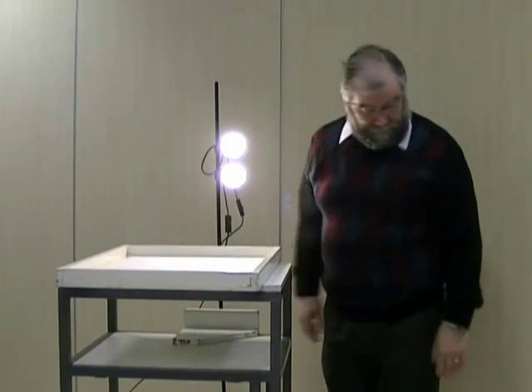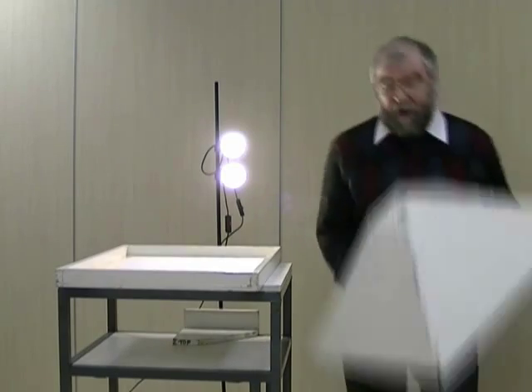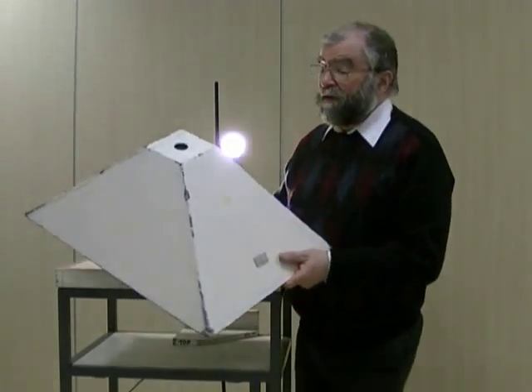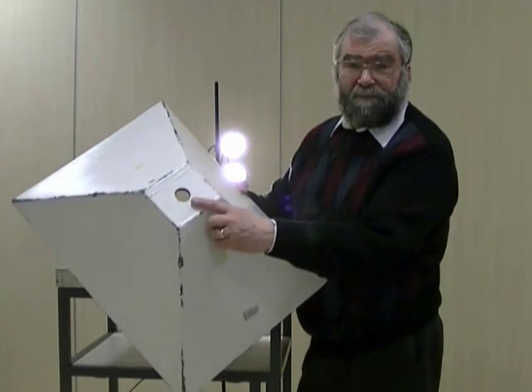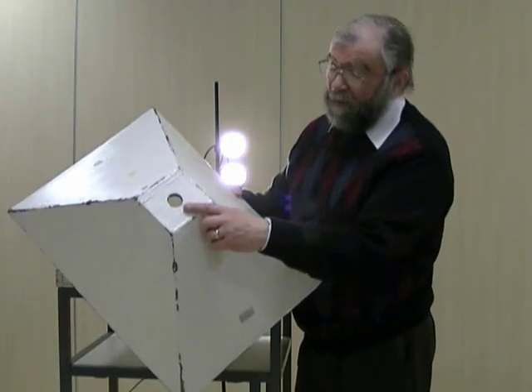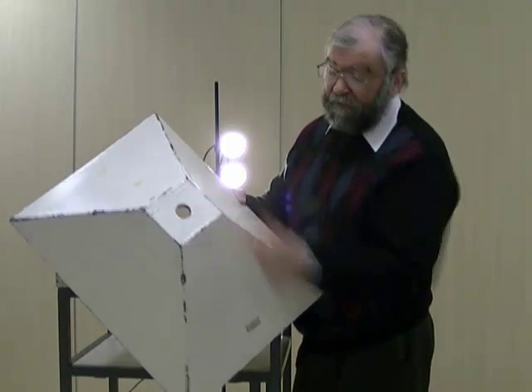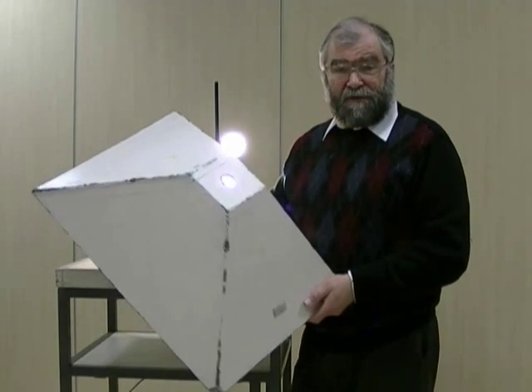For this demonstration of a pinhole collimator, I have an oversized model consisting of a cone of opaque material with a hole at the front representing the pinhole. This is about ten times life-size — a real pinhole is a few millimetres in diameter, while this one is a couple of centimetres in diameter.